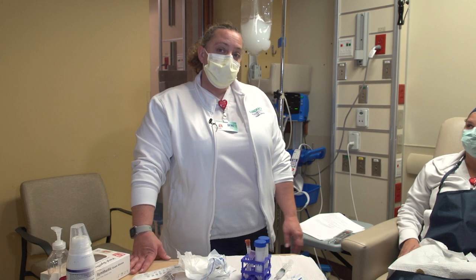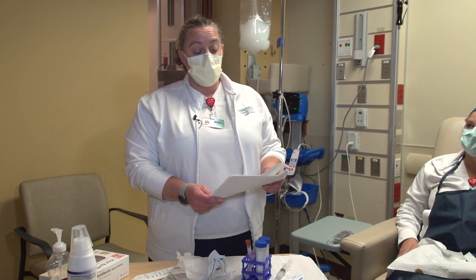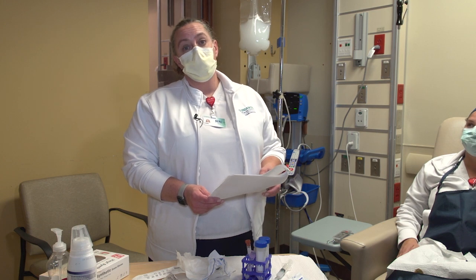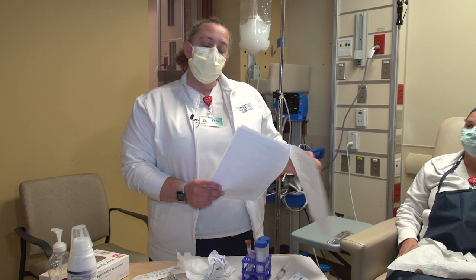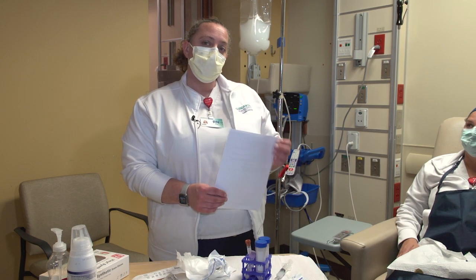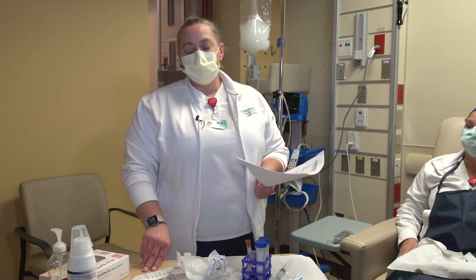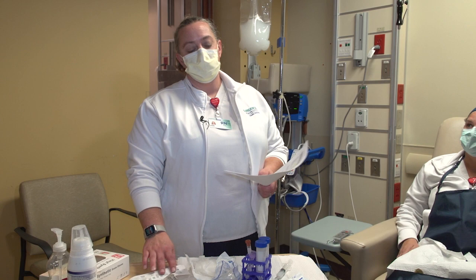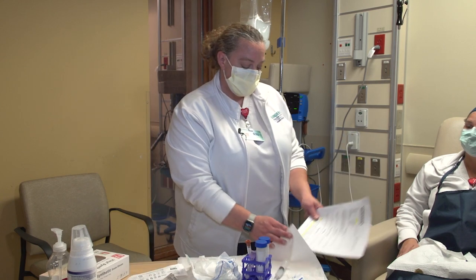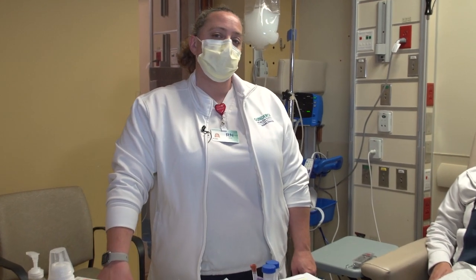Once the cell count comes back, if the cell count is greater than 100, it is positive for peritonitis. You will notify the on-call nephrologist if it's a holiday, weekend, or night, or the primary if it's during business hours. And they will inform you of their treatment choice.